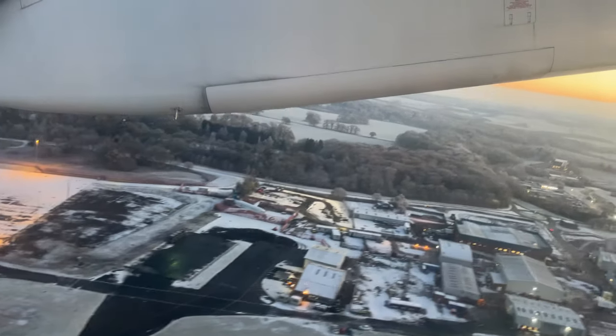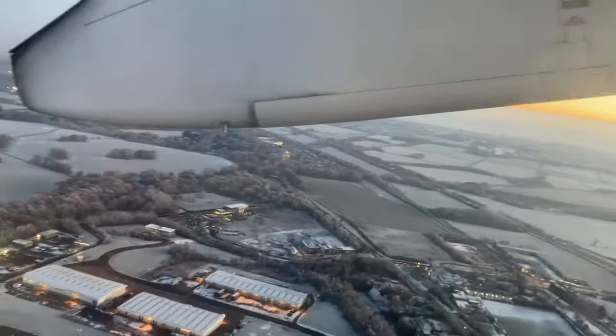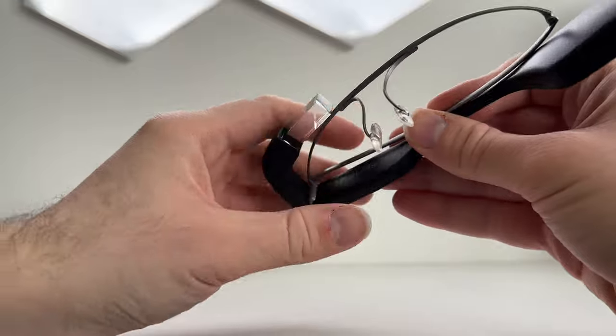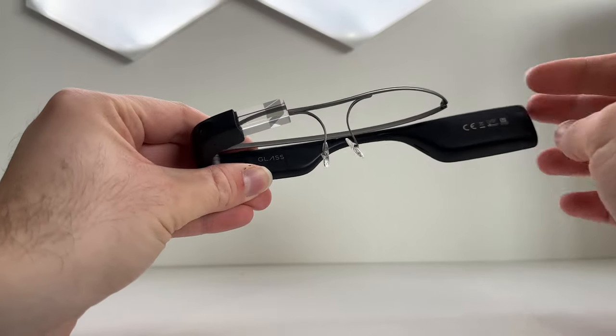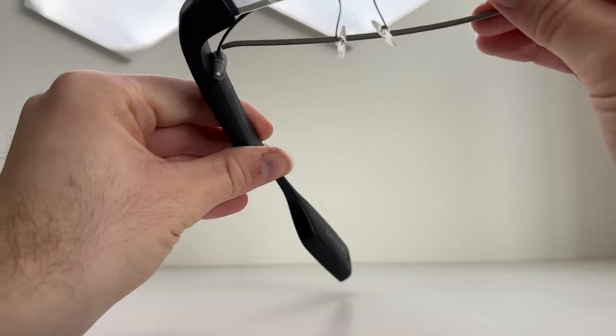Now that we're on the way to London, let's delve a little deeper into the hardware and design of the Envision Glasses. The physical hardware is largely identical for all three editions of the Envision Glasses. With the Reed and Standard Edition, you get the exact same hardware package, meaning you also get the lightweight titanium frames to go with your Envision Glasses.